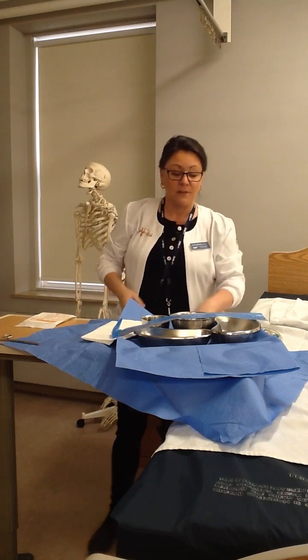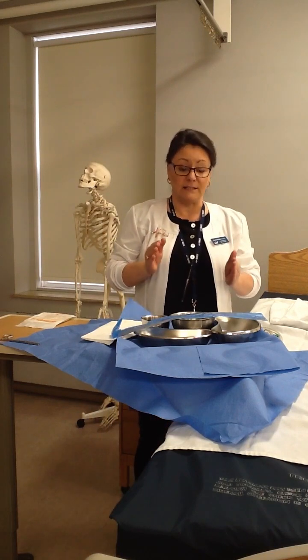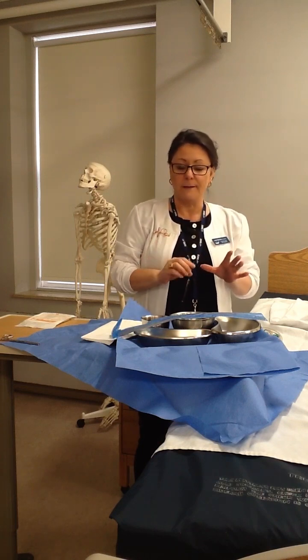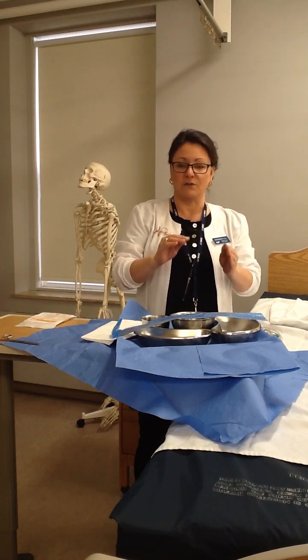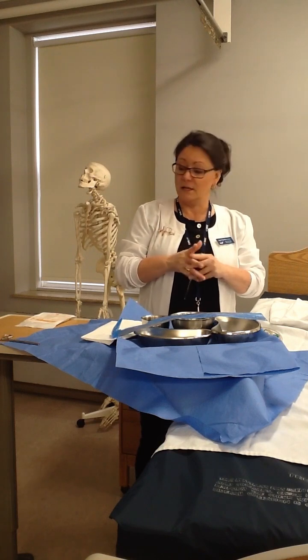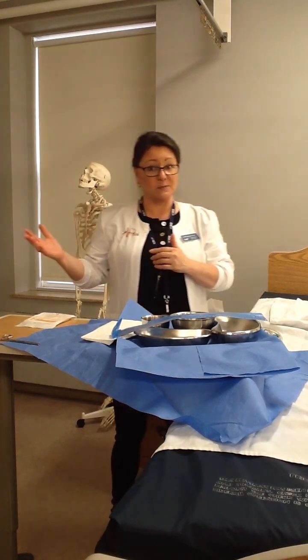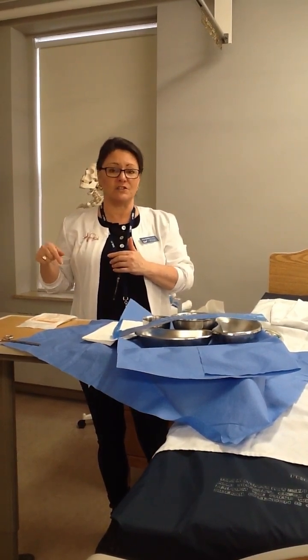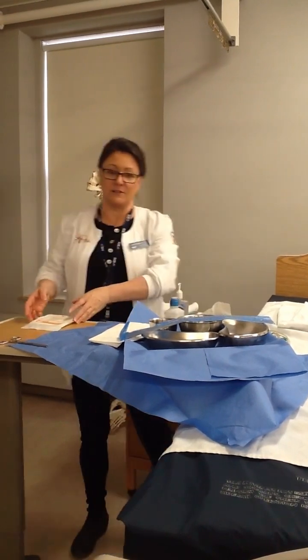It's garbage. And so we can double check our tray and make sure we've added all of the items that we need to do our procedure. Everything is here, we're good to go. We need to do setup next of our catheter and our syringe and so on. So now we need to apply our sterile gloves, because the very first principle of sterile technique is that only sterile can touch sterile. In order for us to be able to play in here, we need to put on our sterile gloves.